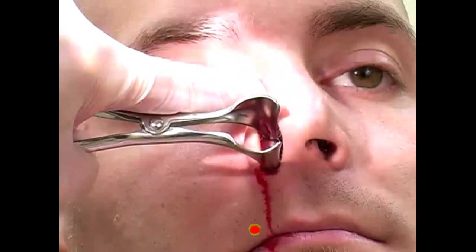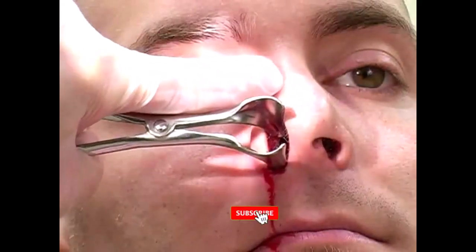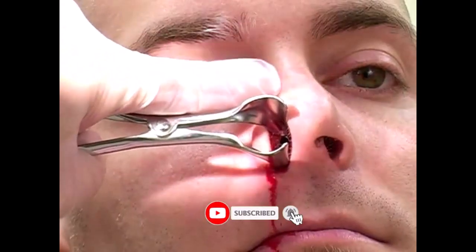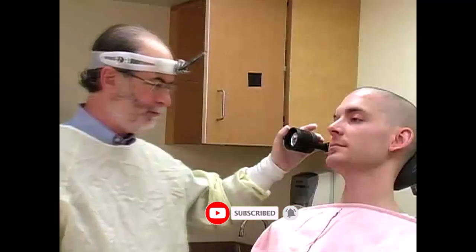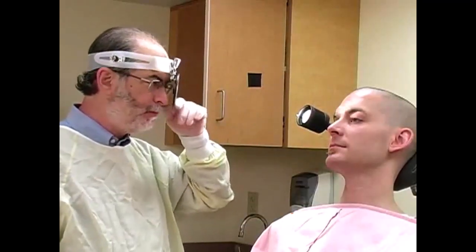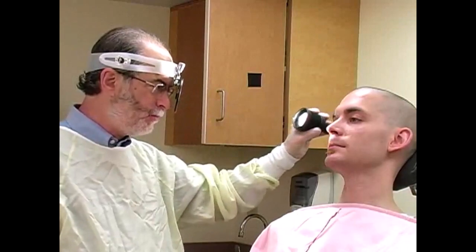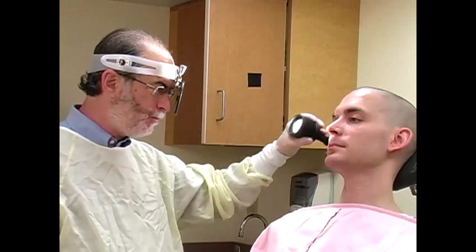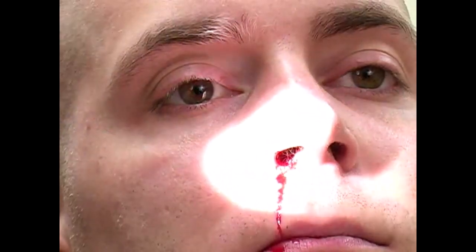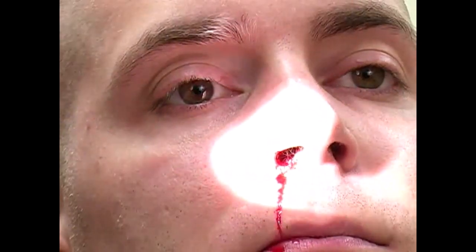Proper visualization of the source of bleeding is essential for management. Use a headlamp with an adjustable narrow beam to provide optimal lighting. In this video, the physician uses a head mirror, which provides excellent illumination of the field.